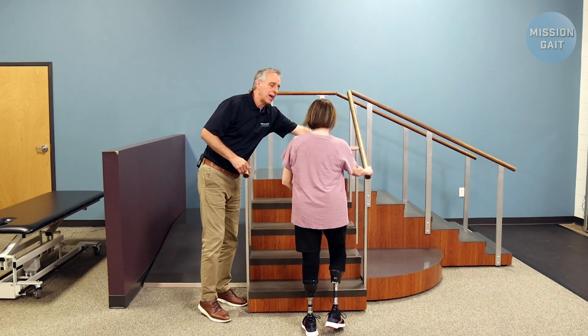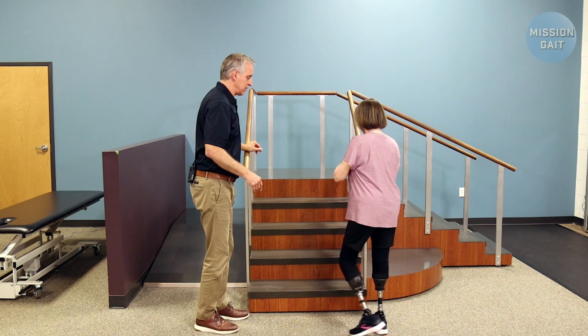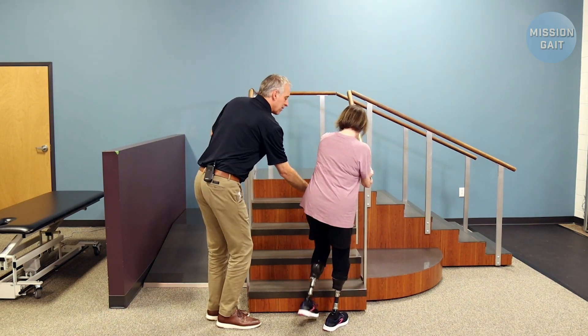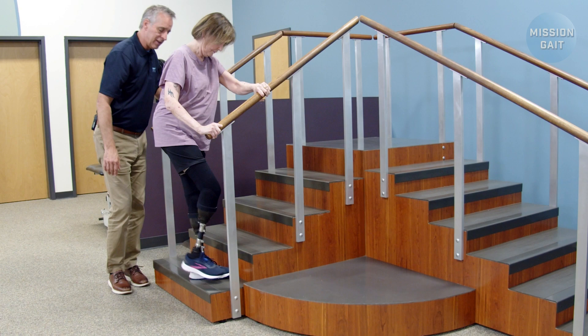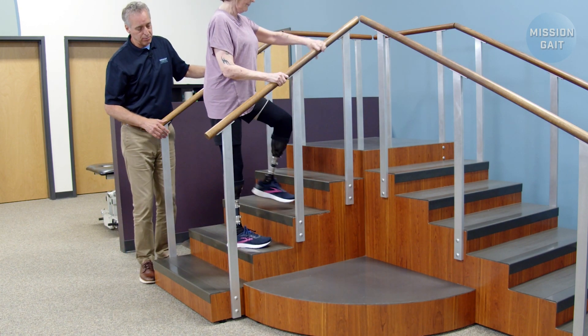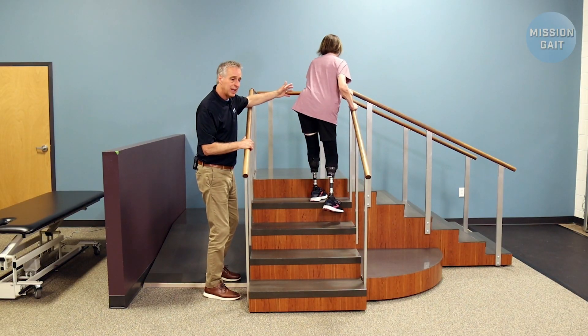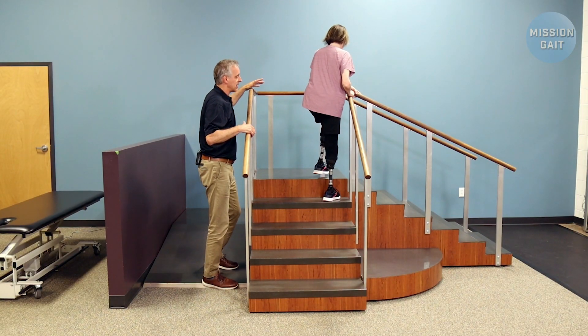Let's assume you only have one railing. If you have one railing, you want to put both hands on that rail. You're going to step up on kind of a 45-degree angle to the step. Get that foot all the way on the step — all the way deep on the step — so you can get that other foot in place. That angle allows her to keep both hands on the railing and give her the stability she needs to come to the top.